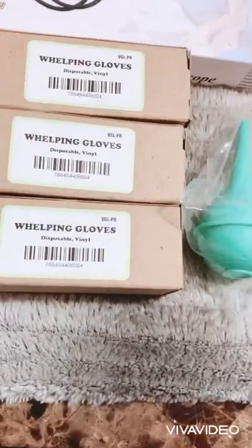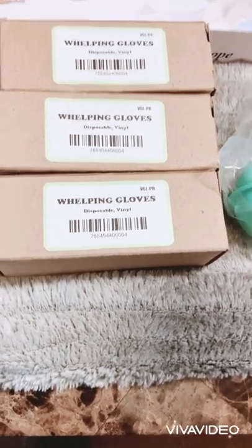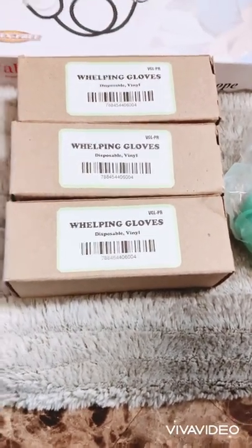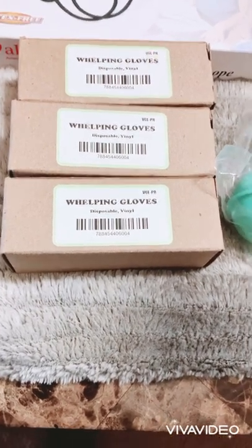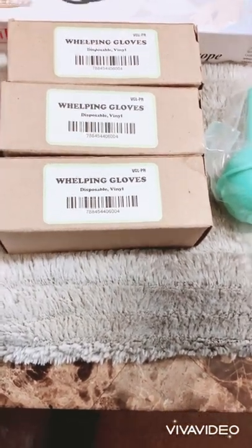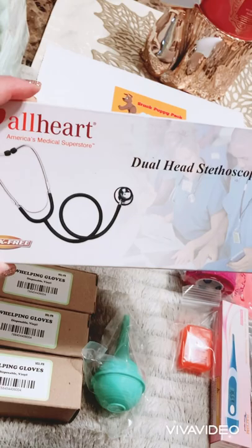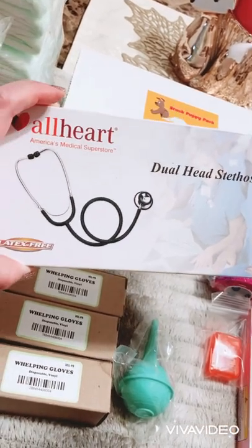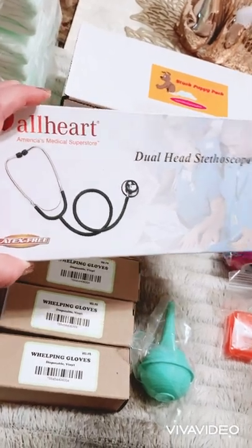Next are the whelping gloves. It's very important to have sterile gloves on hand to avoid any cross-contamination. You should always use them when handling the pups to make sure your hands are super clean and sterile. There's also a stethoscope here, just to check the heart rate of the mom or the pups and make sure their heart is beating strong and clear.